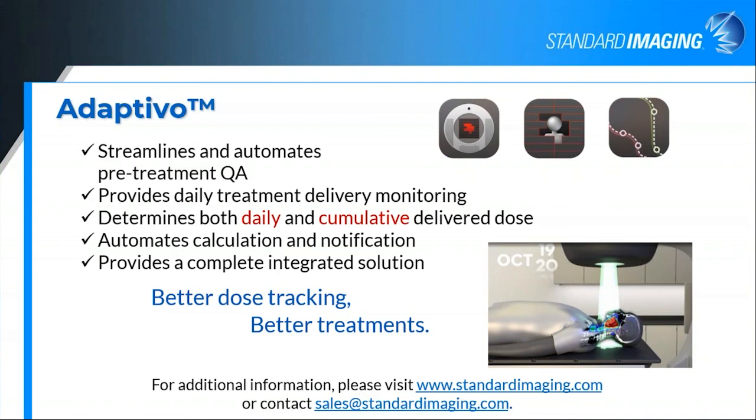Our goal in this product and others really is to give you the complete and integrated solution that fits well within your workflow and works with the devices that you've got, your delivery devices that you're using.